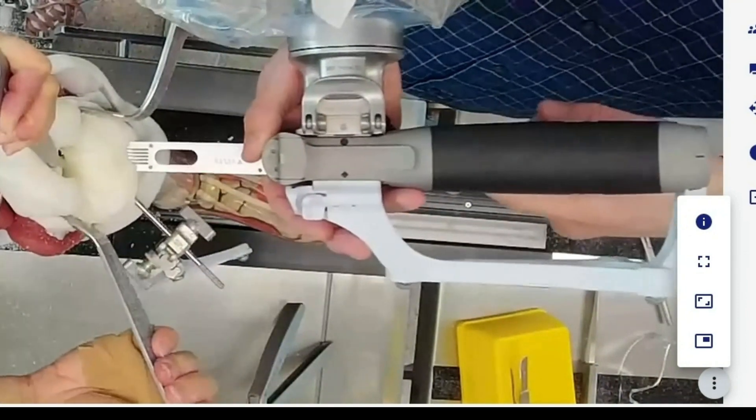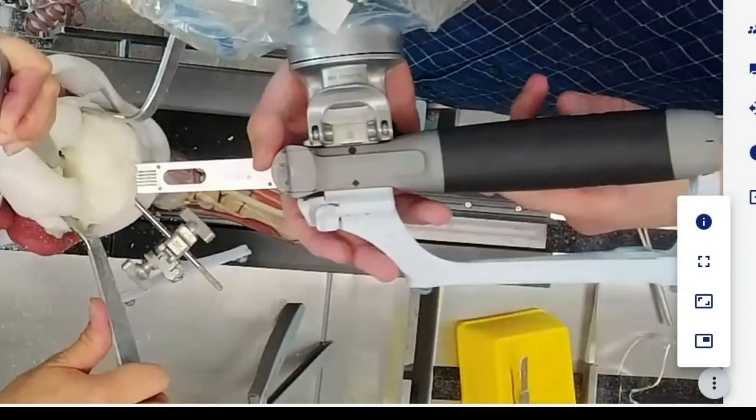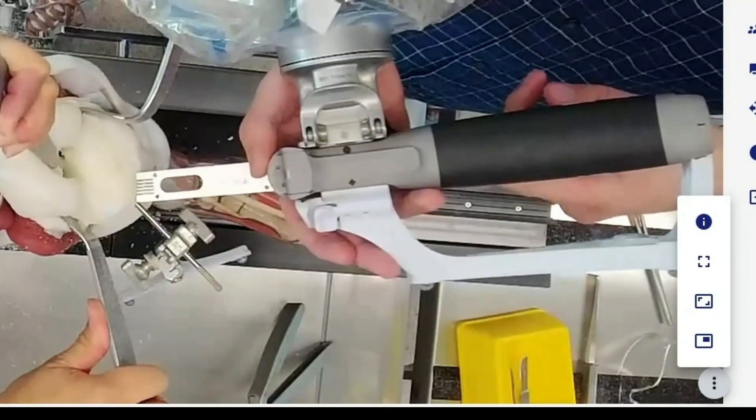Getting through that first layer of cortical bone gives a very firm feel on the saw, and as we enter the cancellous bone I could feel the blade going through significantly easier.